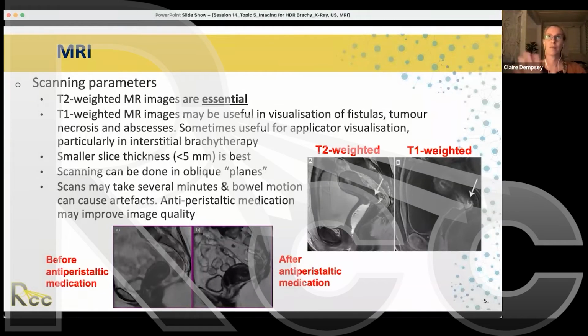No matter what image data set you use, it's going to think your patient is really just a box of water. So at the moment, that's actually an advantage in brachytherapy over external beam planning systems, because with external beam, you need to have that CT data set to have the tissue and electron density information, but we don't need that in brachytherapy. So you can plan straight on an MR image in brachytherapy, which is really useful.